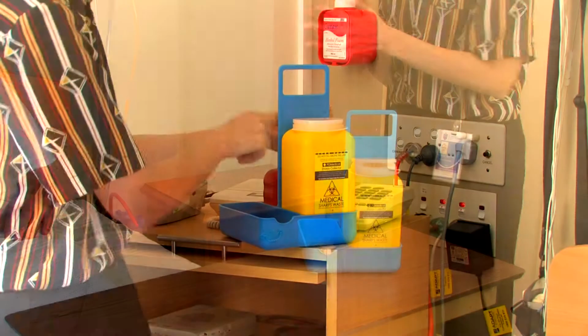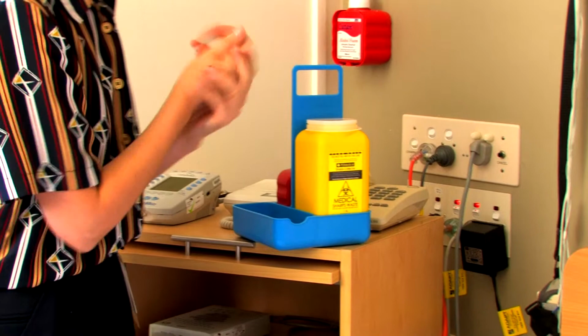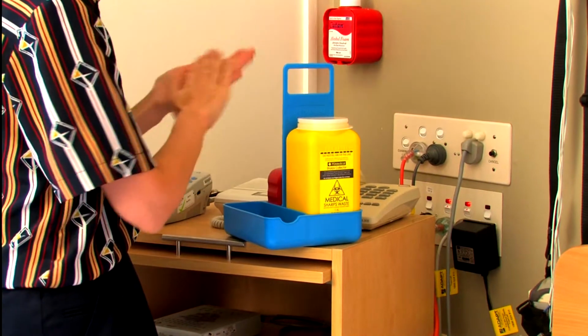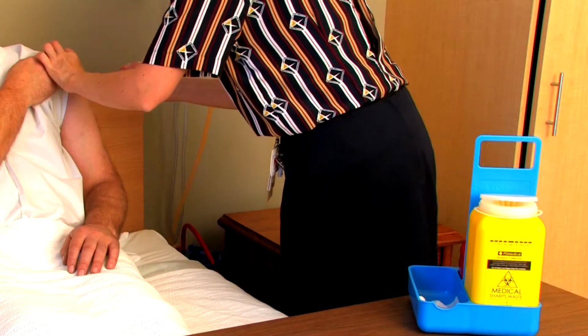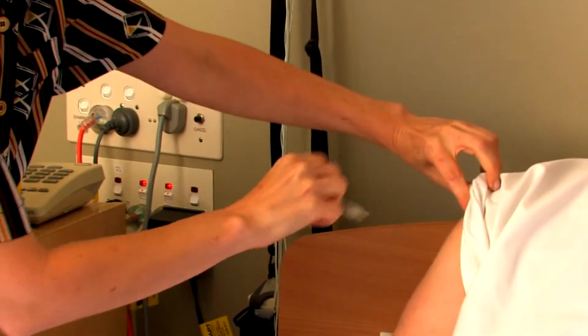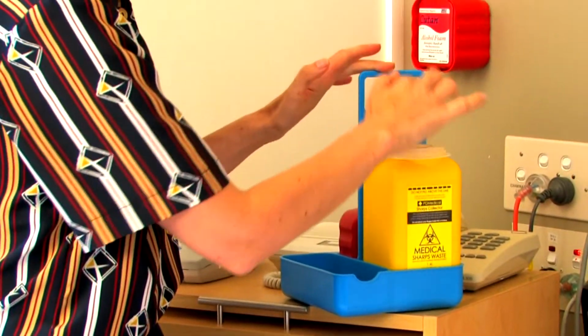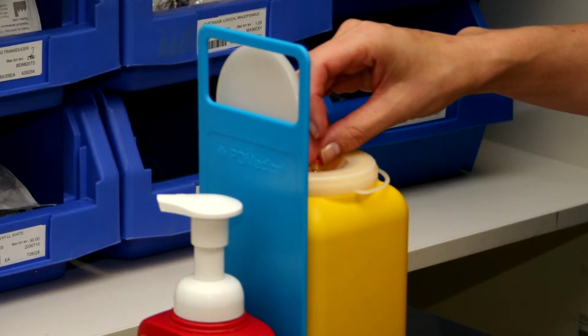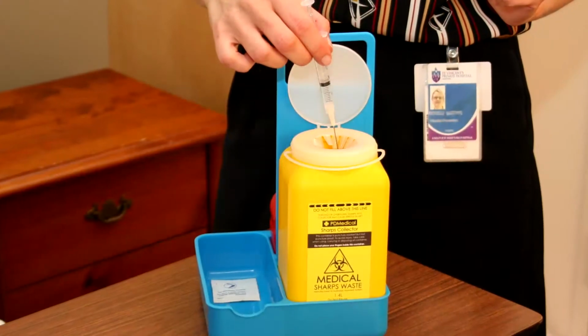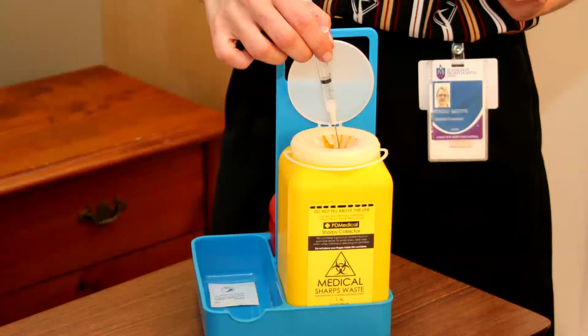The proximity of the alcohol-based hand rub is a reminder to clean hands immediately before the medication is administered to protect the patient from harmful germs, including their own, from entering their body during a procedure. The sharps container enables a nurse to dispose of the needle immediately following use and minimise the risk of accidental injury. Remember that 86% of injuries are preventable, so having the container at the point of use removes a majority of risks at a time where the needle may be contaminated.